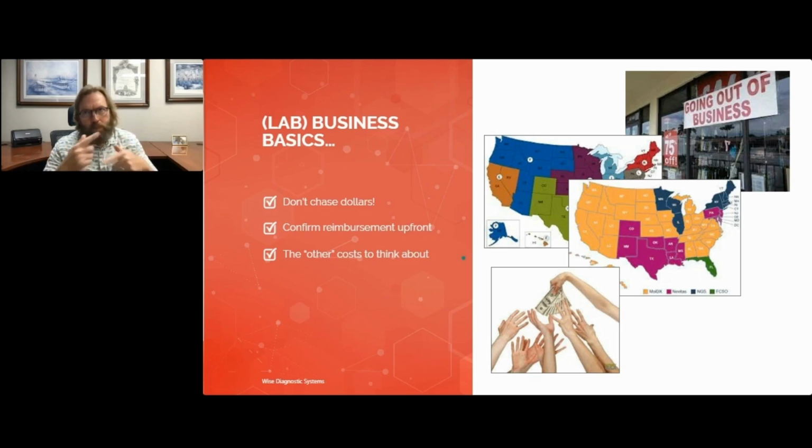When people talk like that, the first thing that comes to my mind is, that's great, but I don't really understand a whole lot about the test and how useful is it? Because what you don't want to do is just start building a test menu based off of what you think revenue is going to be, because that's not really a business plan. That's not really trying to serve a market. That's really just trying to figure out how do I generate revenue?